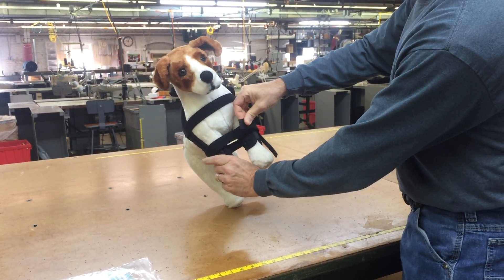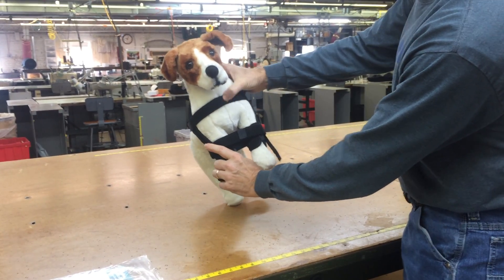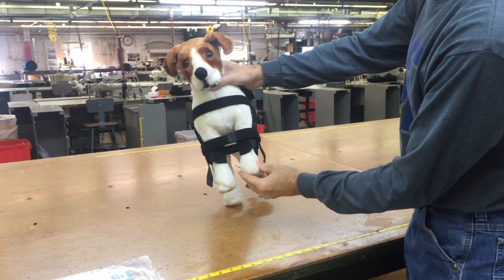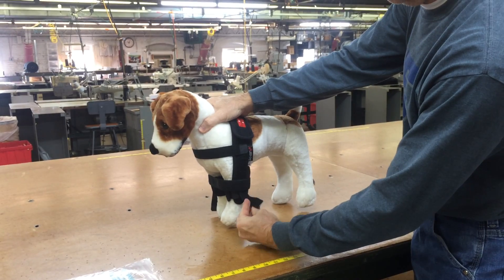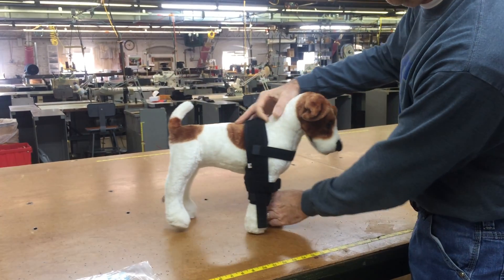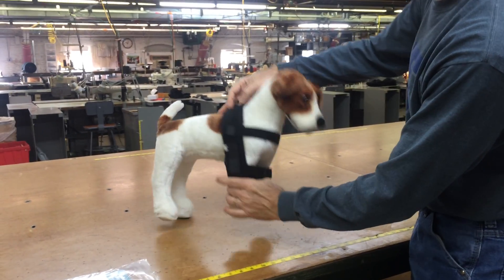Once the desired restriction is achieved, attach the end of the hobble strap to itself. The final step is to fold the bottom of the hobble tabs up to make a belt loop. The hobble tabs hold the hobble strap at the desired position.